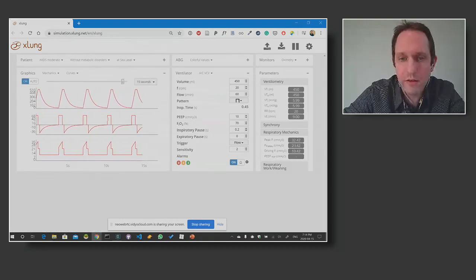And of course, as it was already mentioned, when patients worsen, you have to set alarms based on these parameters, specifically your peak airway pressure. Your volume will not change, your minute ventilation will not change. Small changes may affect your CO2 because your tidal volumes are changing, but with volume assist control, that doesn't happen. You do have to monitor this.